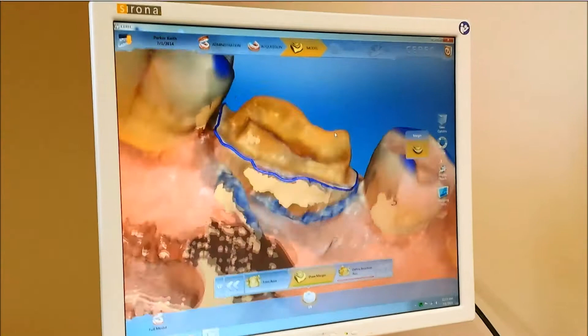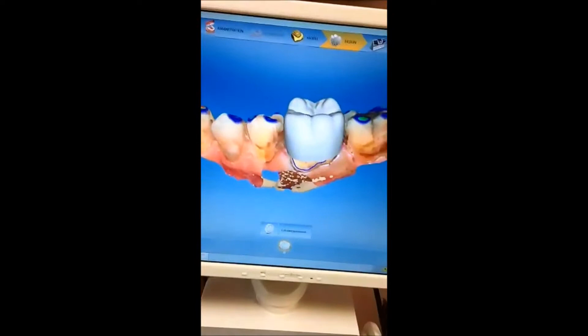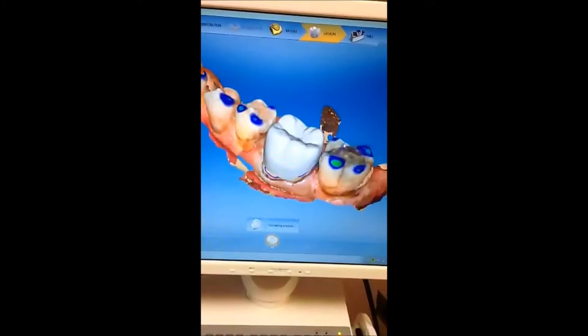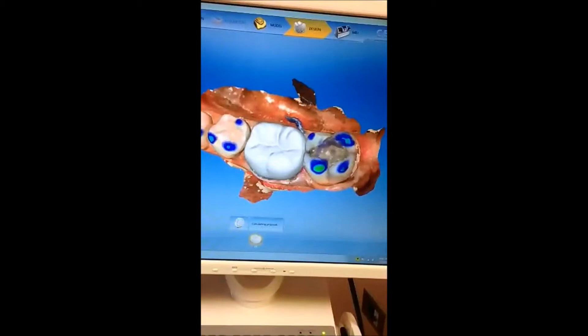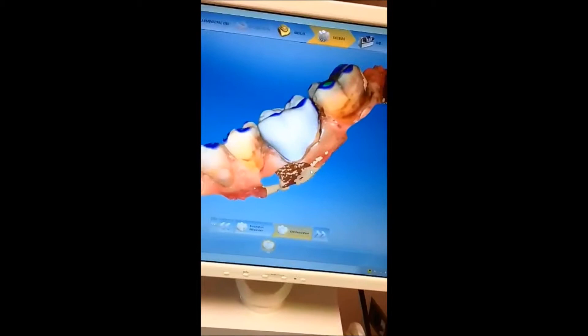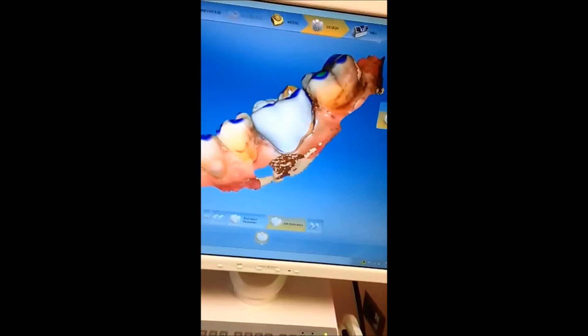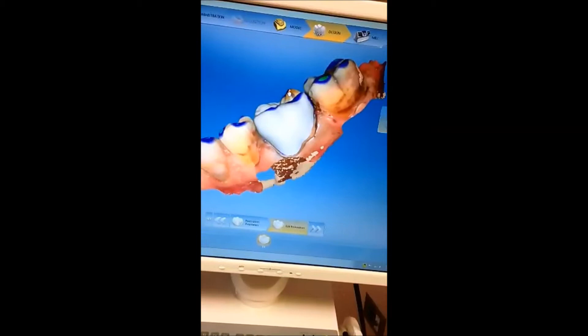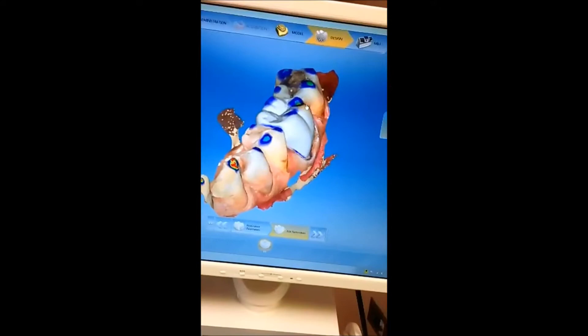So this is where the software uses the size and shape of your teeth to calculate the new crown restoration and designs your final restoration. And then what we can do is change the shape by adding little nuances and making sure that we like all of the fit.